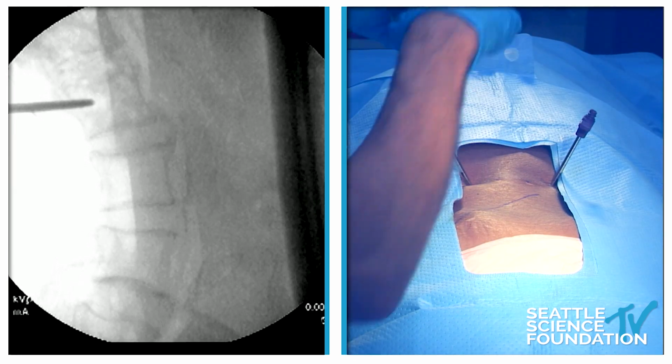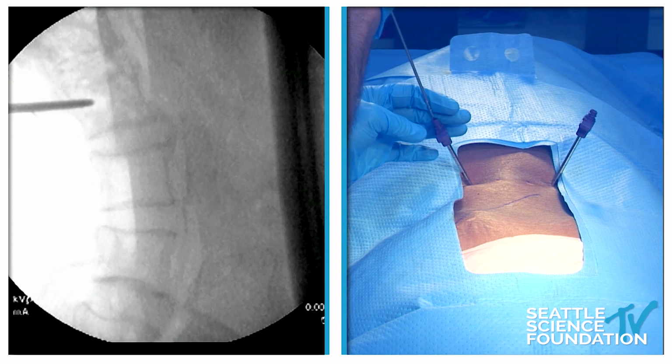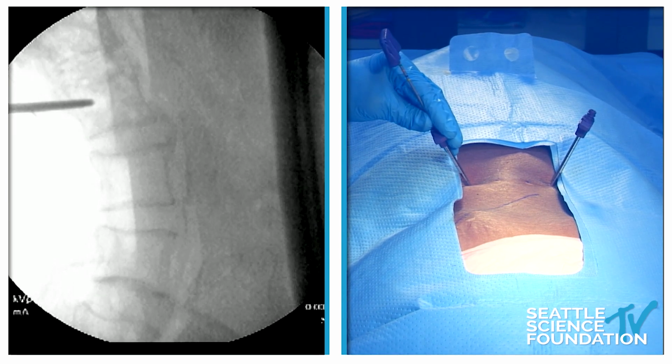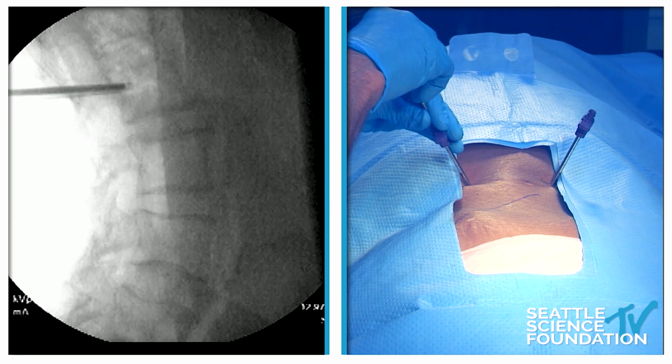Now, when you're shooting these laterals, you usually have the vertebral body being treated in the center of the field? Yes. I'm fastidious about it, so parallax won't overly suffer. Yeah. A radiologic technique, because Victor's doing an awesome job.